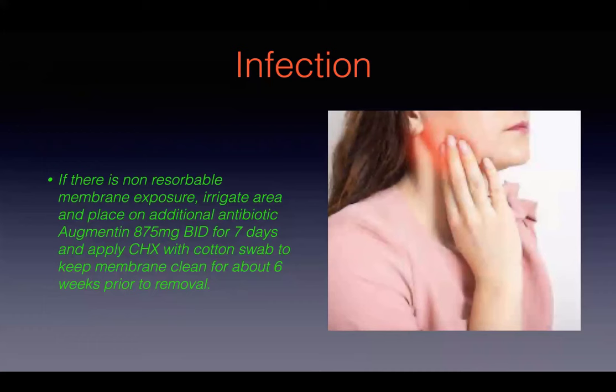Josh, you're asking, when doing a simple socket preservation with a smaller fenestration or even larger defects with an intact periosteal membrane, flapless extraction, would you place a non-resorbable membrane? Yeah, I would. Michael Shin, on narrow ridge augmentation around the lower molar, do you augment both the buccal and lingual, or only buccal? I do buccal. It's extremely hard to do this on a lingual. So I do a buccal decortication to get that bleeding, and then it's just easier access and easier to build it that way. From the lingual, no, I don't do that.